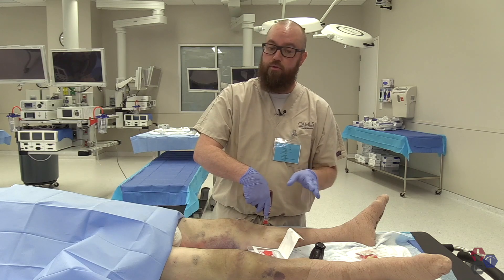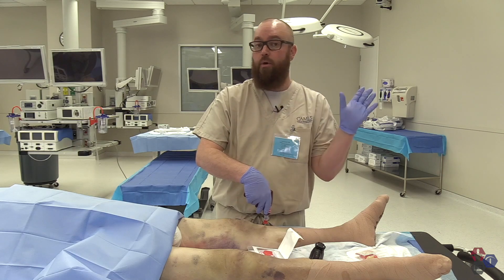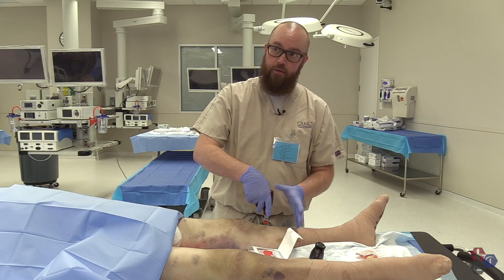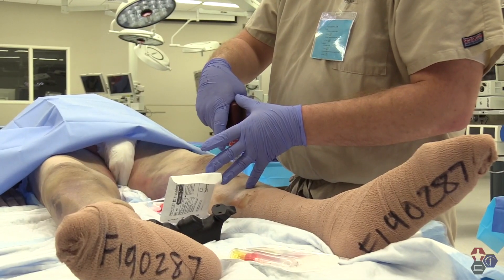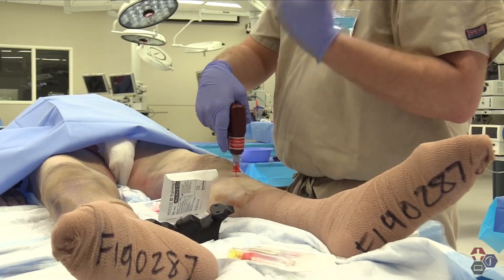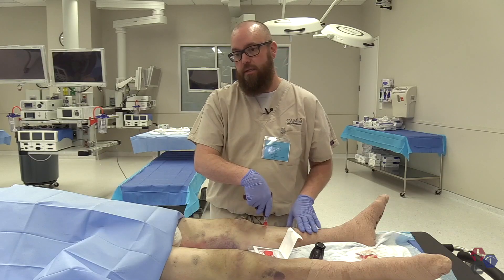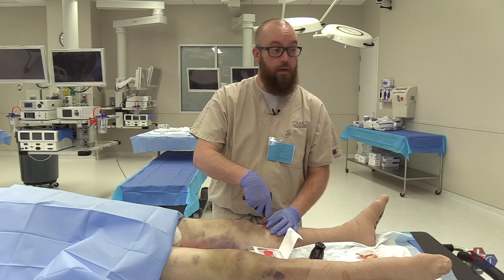As soon as you start pulling the trigger, it will begin boring through the bone. As soon as you feel give of the cortex, you want to stop — you're in the inner bone and you're where you want to be. You can hear it bore down a little bit, and right there is where you stop. You've come through the cortex. If you go too deep, depending on body habitus, you risk driving the needle into the posterior cortex, making the line unusable.